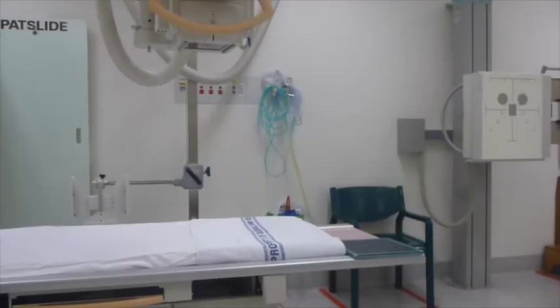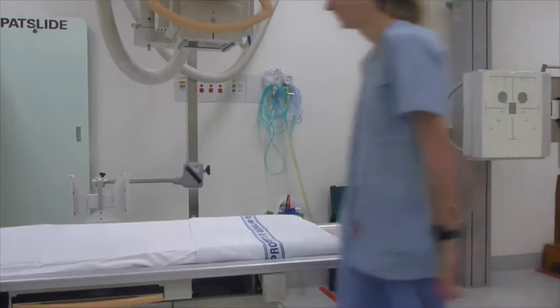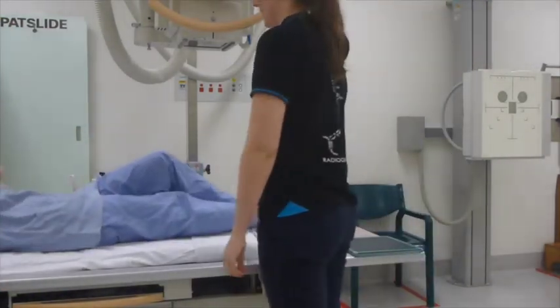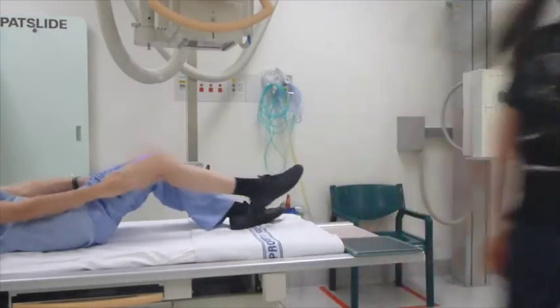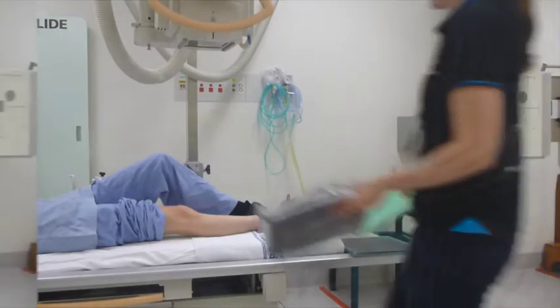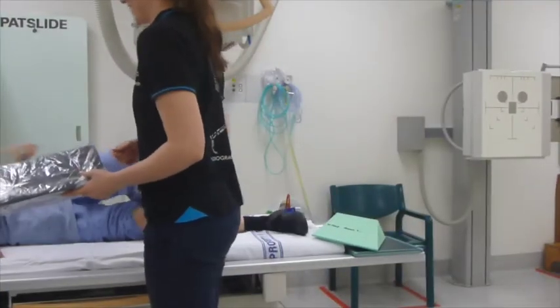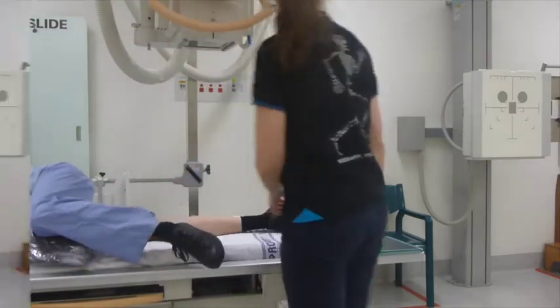Now I will demonstrate how to perform this technique. Bring the patient into the room and ask them their name, date of birth, and what they are having x-rayed. Get them to lie on the table and expose the leg that we are x-raying. We would then perform the AP projection and move on to the lateral. Get the 45 degree sponge, as seen here, and ask the patient to roll onto their right side, the affected side, and put their opposite leg over and onto the sponge shown here.